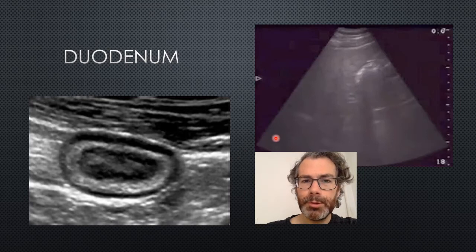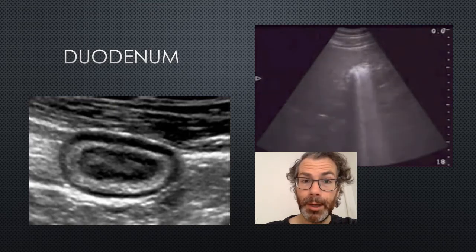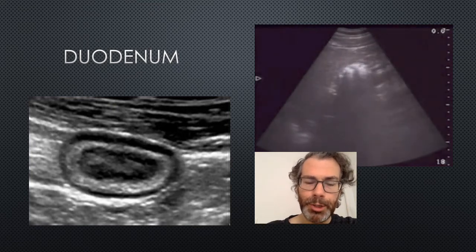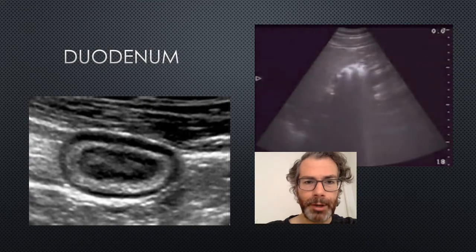In this image, it looks like it could be the WES pattern that we mentioned earlier, right, with the wall echo shadow, and it's nestled into the gallbladder fossa here. But if I play the clip, you'll see that there are actually some ring-down artifacts, these bright white lines that are known as B lines in lung ultrasound. They're the same thing. Any gas-fluid interface will cause this phenomenon. If you see this, you know this is duodenum, so there's a bit of gas and fluid within the bowel causing this ring-down artifact.